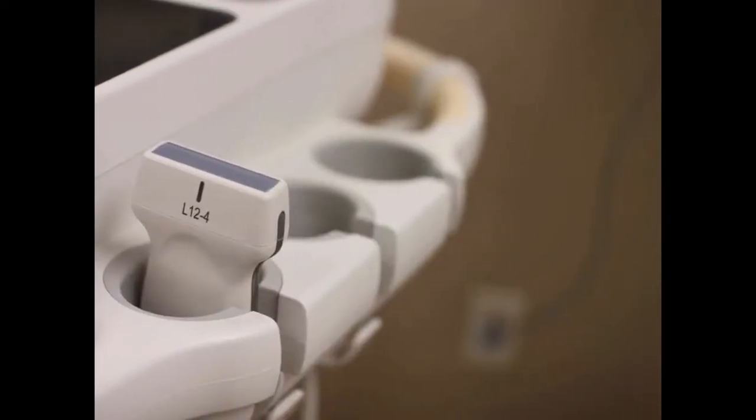Your probe of choice for this examination is going to be the linear probe. Anytime you're doing any kind of procedure with a needle, the linear probe is going to be your probe of choice.